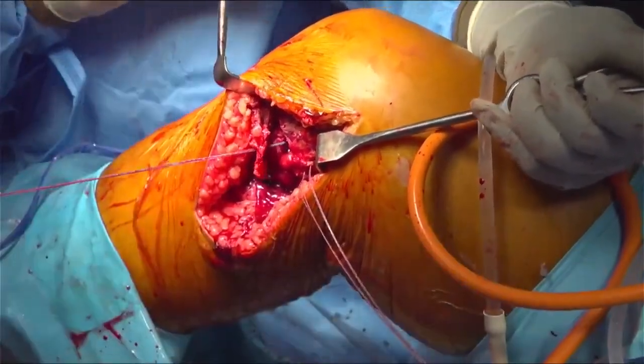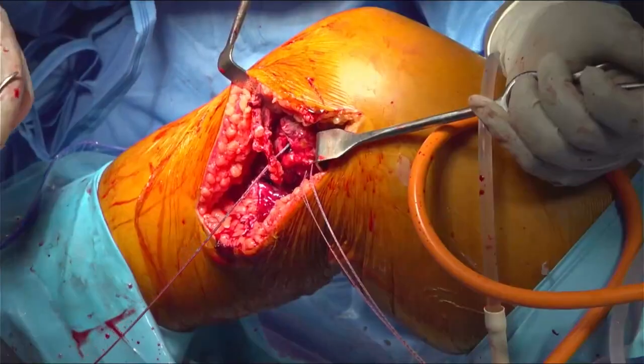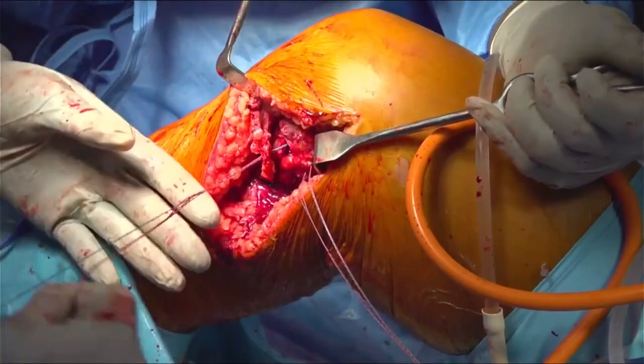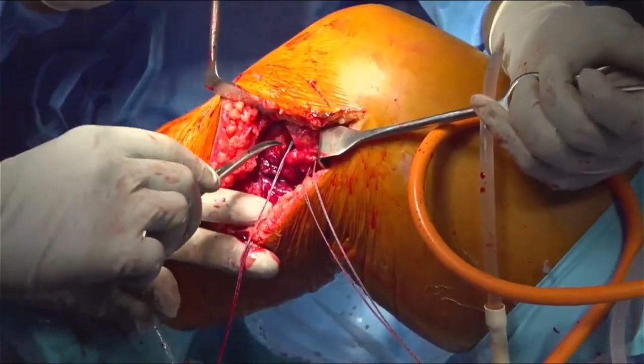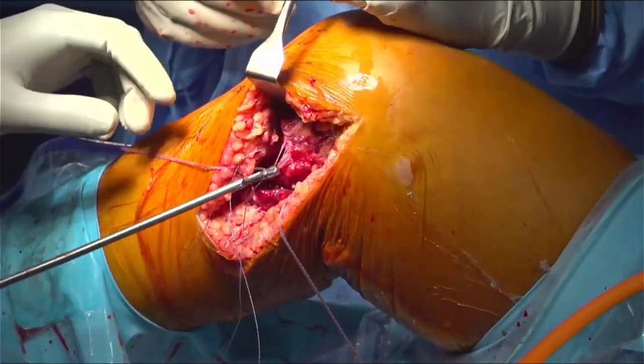Second then. After that, we will be passing the anterior ones. So one at a time.